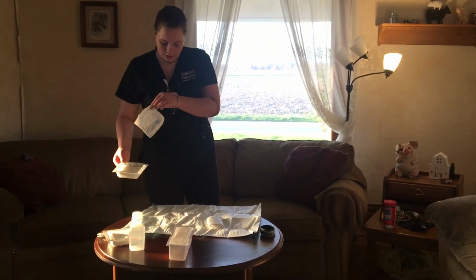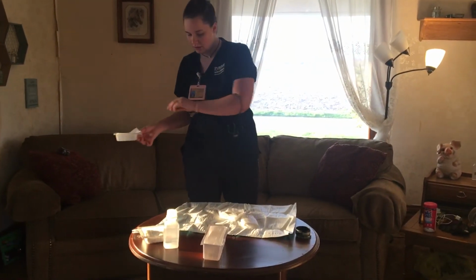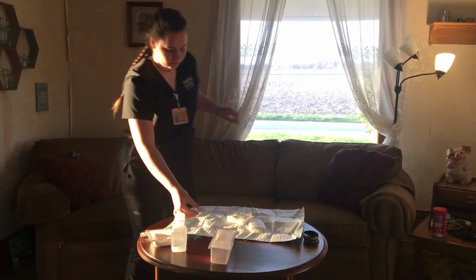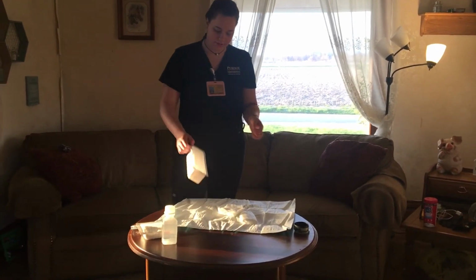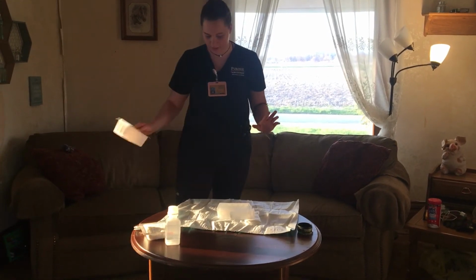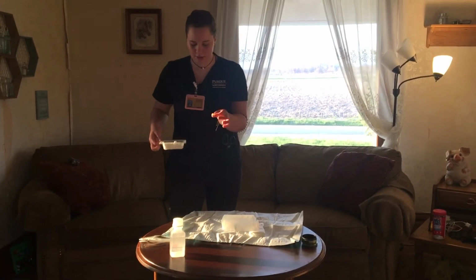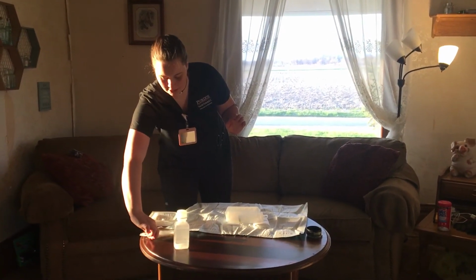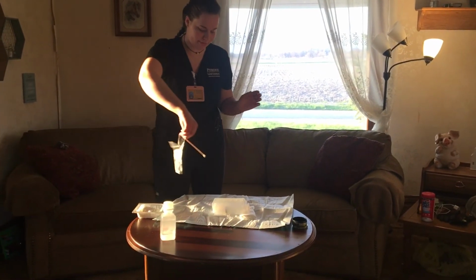So you want to peel the top off, introduce your gauze, get rid of this. I'll start with this. And then you want to open this, introduce it to the field. Make sure it's 6 inches. I know that was not 6 inches. You'd open this gauze packet. You'd open these Q-tip things, which were already open, so.